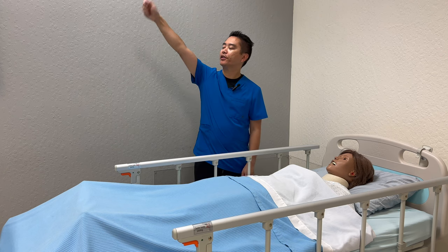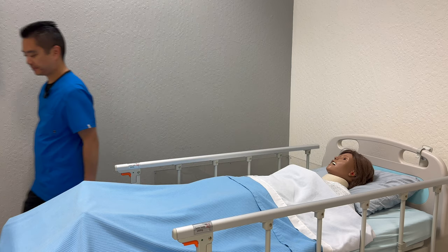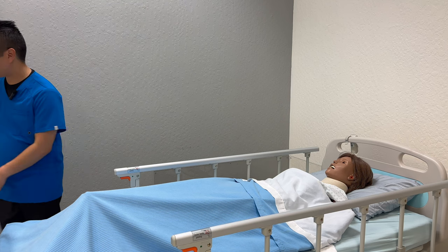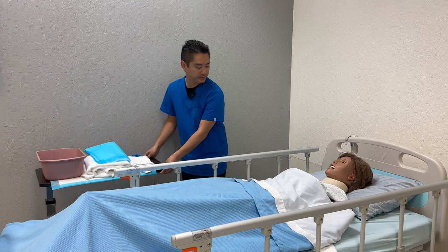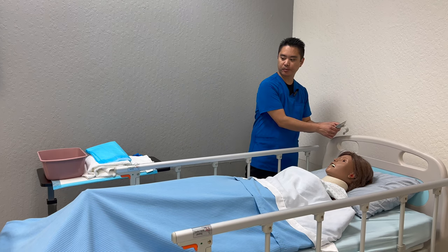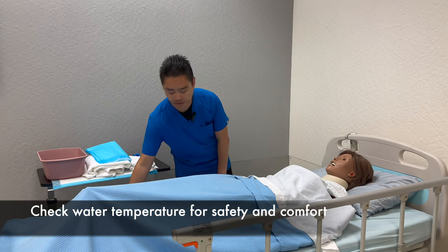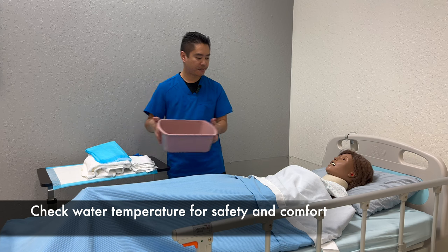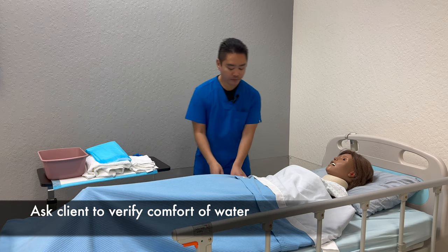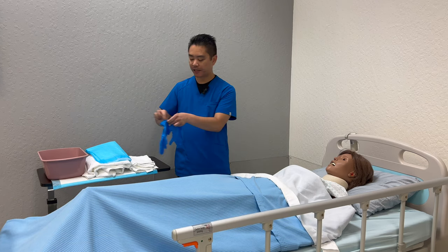I'm going to close the curtains, wash hands, and then grab my supplies. Knock knock, I'm back — I have the supplies. I'm just going to raise the bed to a comfortable position and lower the side rails. I'm going to test the water temperature. How's the water temperature for you? It's good? All right. And then I'm going to place a chuck underneath you, so I'm going to put on some gloves.